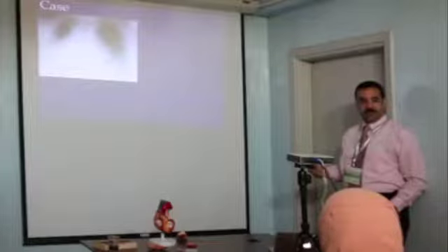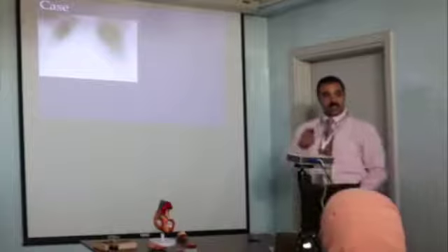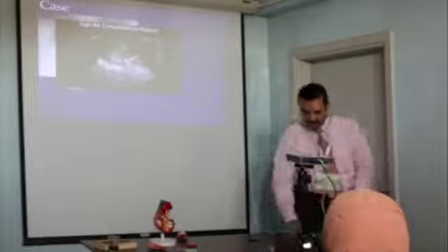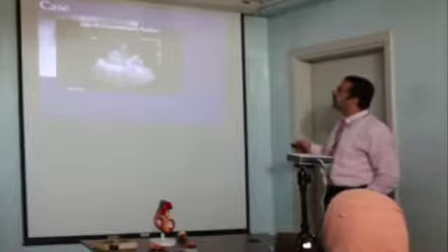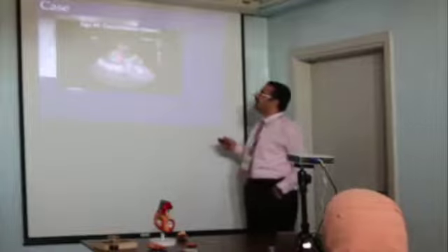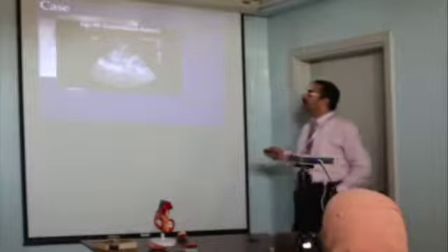Do you feel happy to diagnose this X-ray, or do you feel I'm not happy to give a full diagnosis? Yes. It could be a differential diagnosis. That's why we say ultrasound is more sensitive and specific than the X-ray. Let's see. If I see this picture in the ultrasound, this is the liver and the diaphragm, and you see this picture. If I see thick pleura with plaques, and this area of air bronchogram, I can say it's pneumonia.